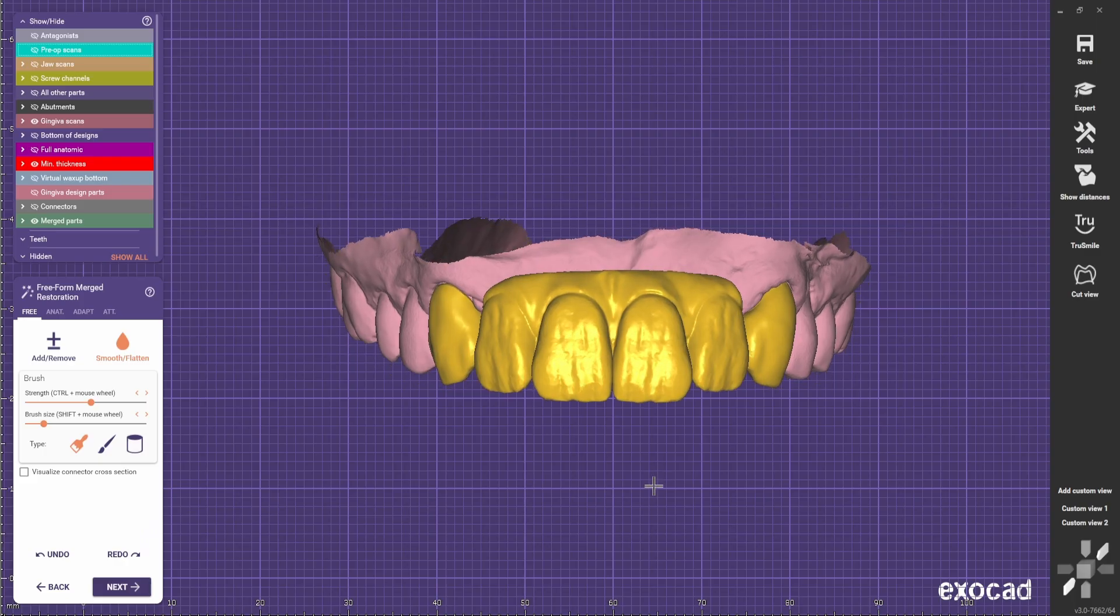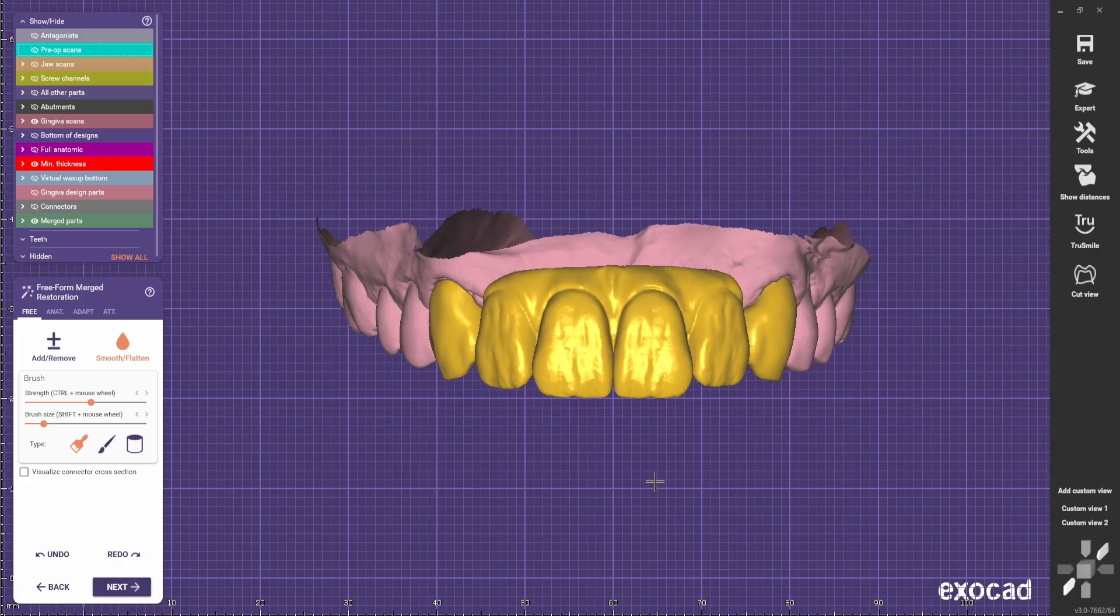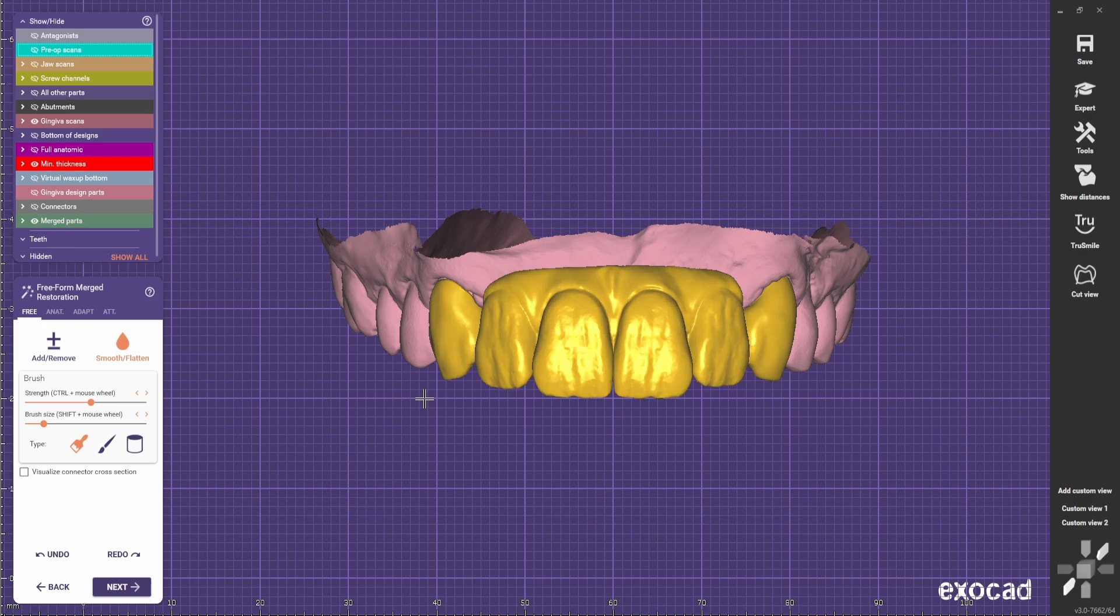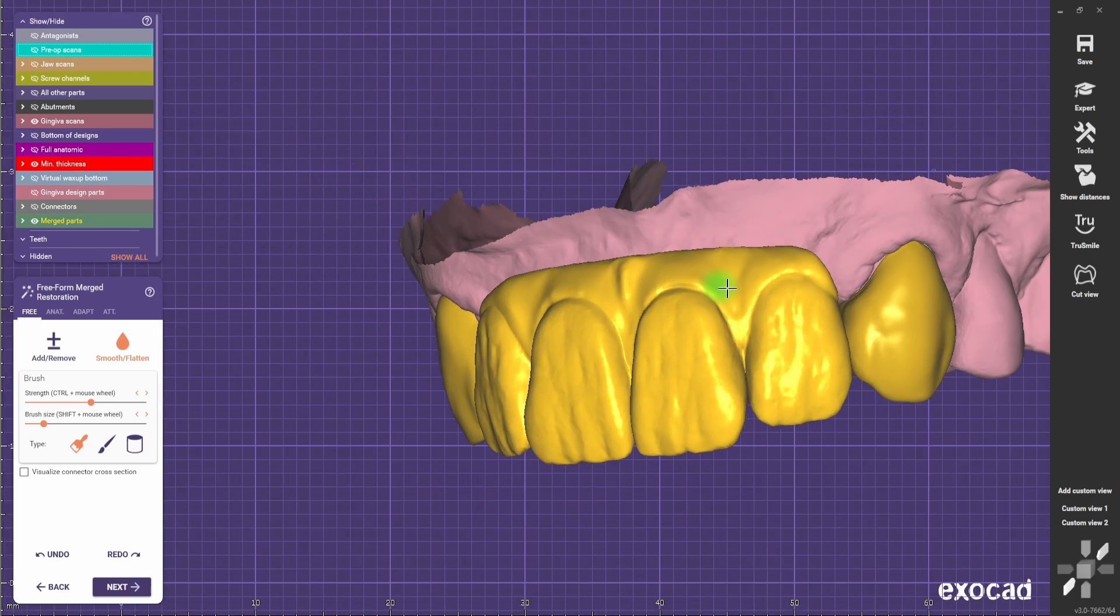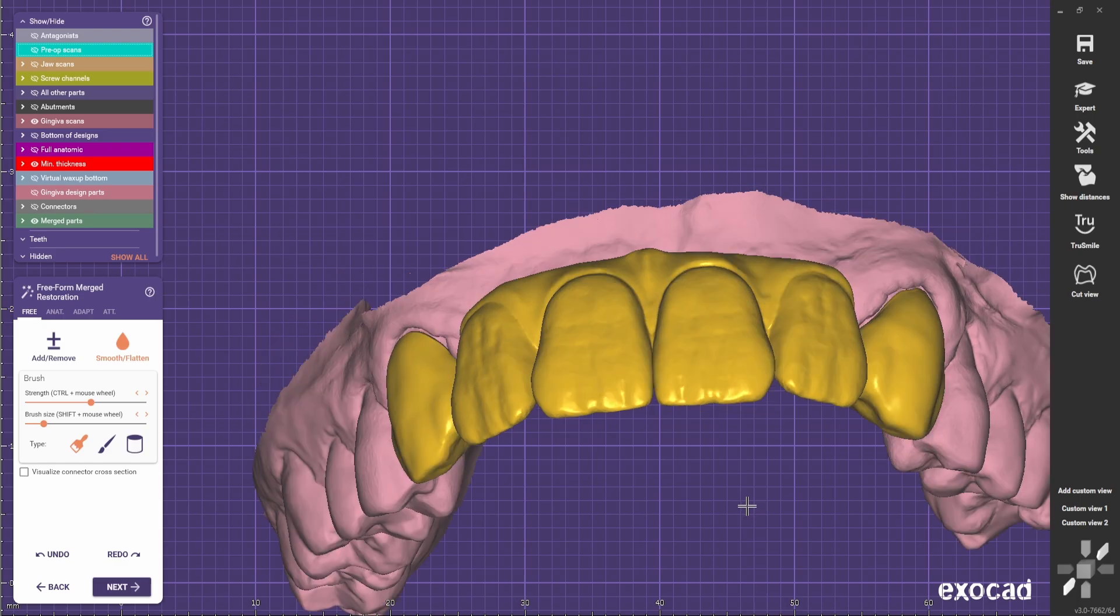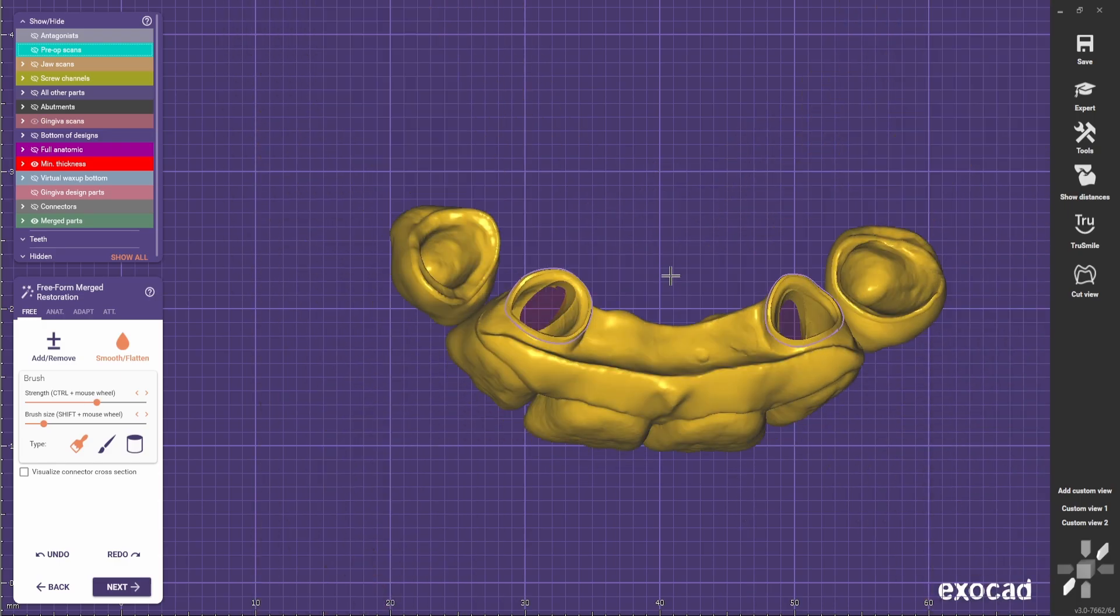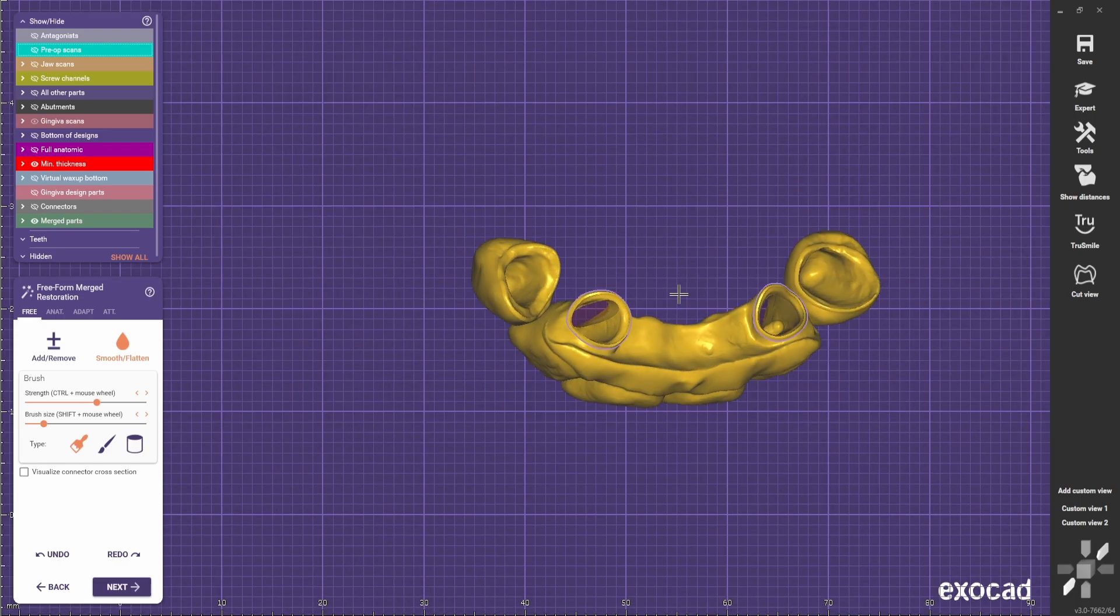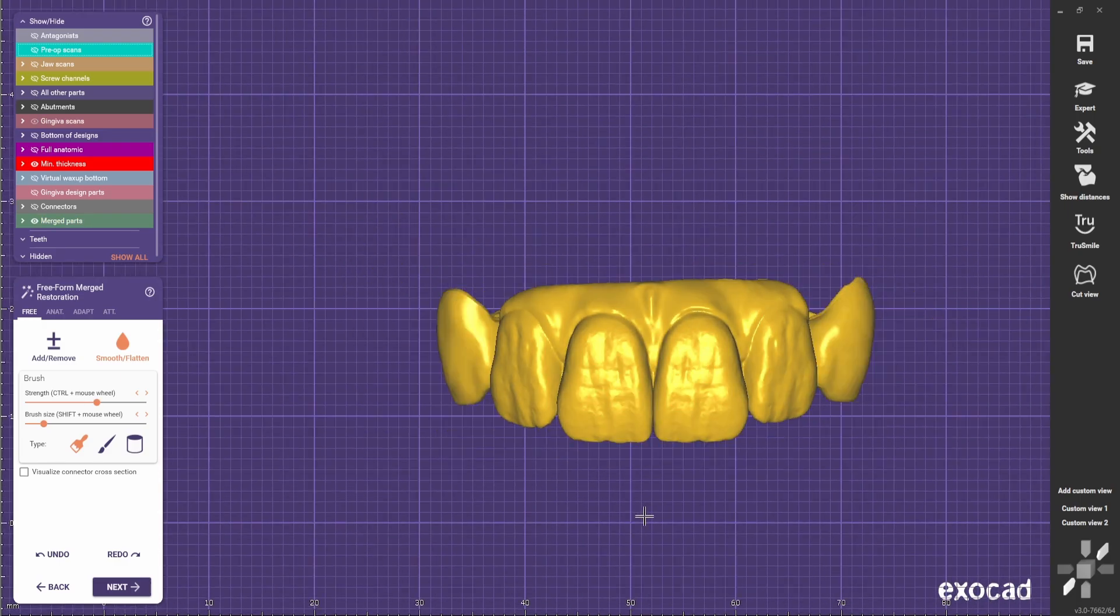So in the last video we did the setup of this case. It's two single canines and a bridge from lateral to lateral. Today we are going to improve the gingiva to make it look realistic and also design better the sitting area on the soft tissue.